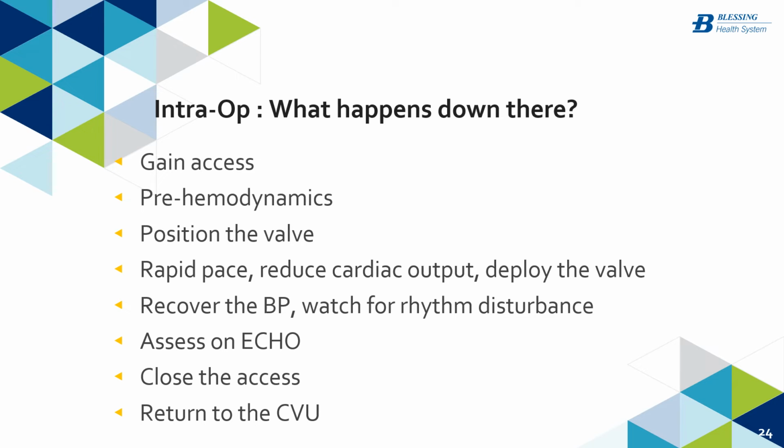They'll position the valve and get it right where they think it needs to be. We will use that pacemaker to rapid pace the patient, reduce their cardiac output, and then deploy the valve. So we use two different kinds of valves.